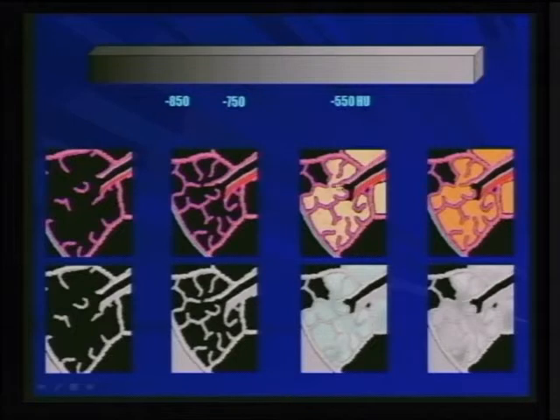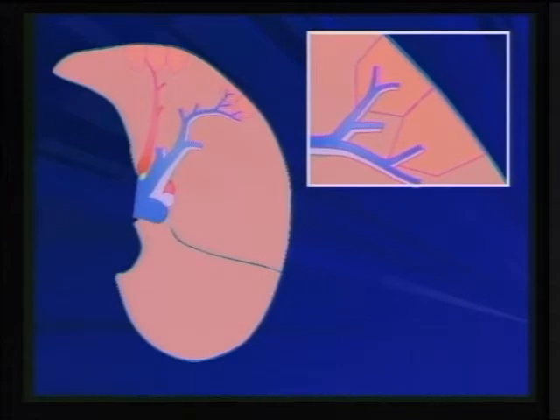And then, of course, with different involvement or different concentration of disease within the alveoli, you may see different degrees of involvement within airspace disease. So a few examples of decreased opacity. A good example is centrilobular pulmonary emphysema. And again, we say centrilobular because it does happen within the center of the pulmonary lobule.